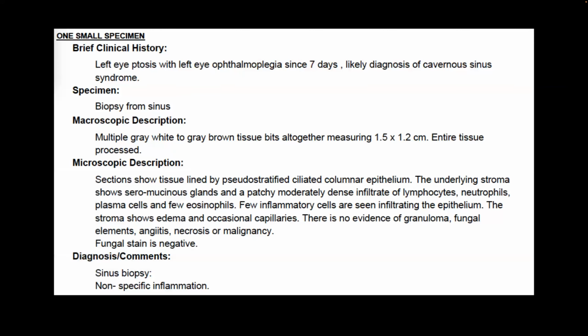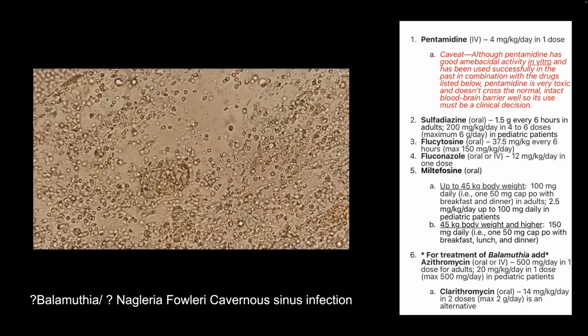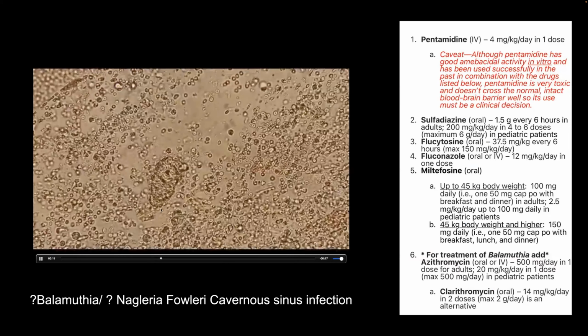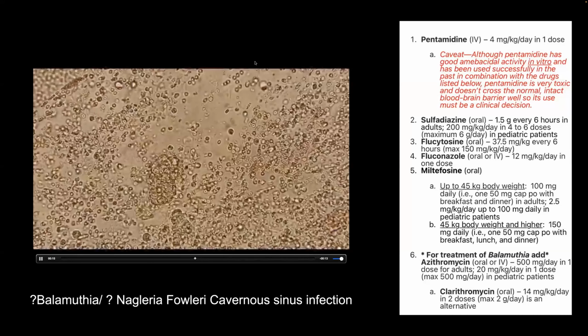I'll get back to that, but there is a video. The biopsy was done, and wet mount preparation and culture sensitivity were sent. So this is a wet mount preparation, which shows a free living amoeba, the moving thing that can be seen.